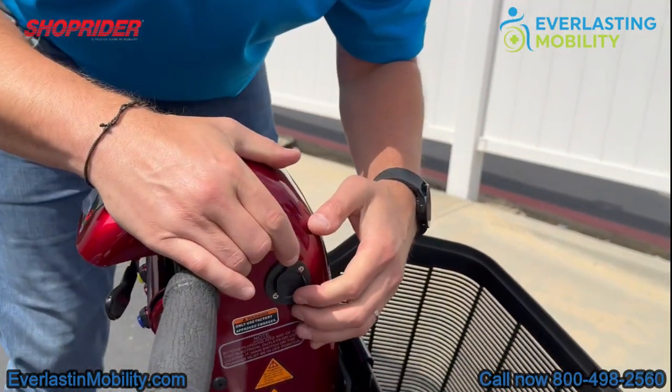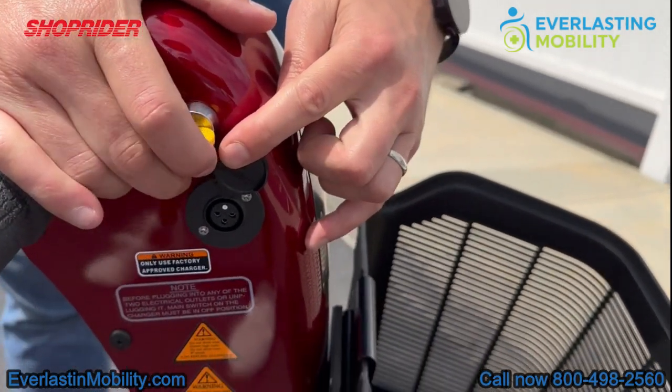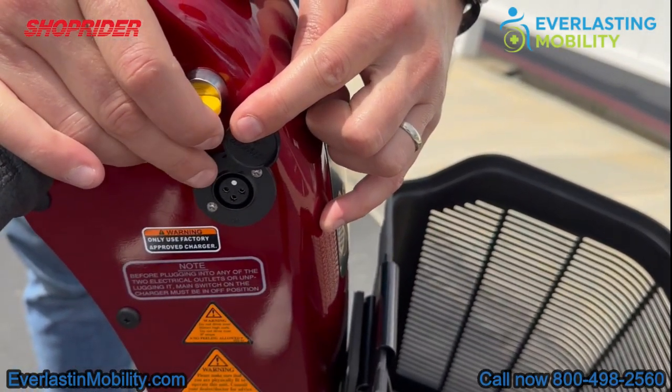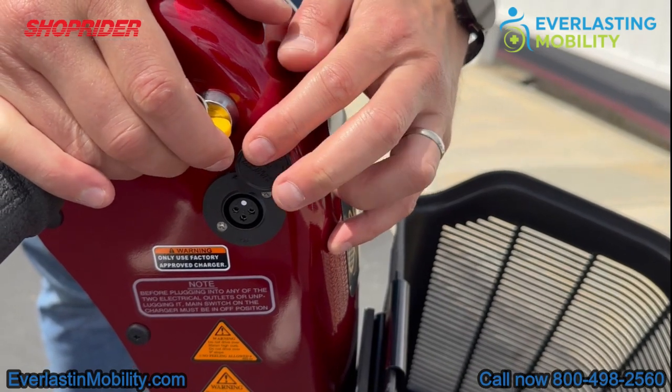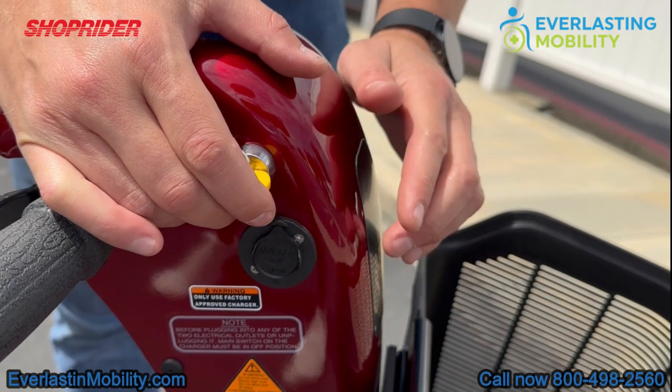The charging port is located up high on the tiller, which is a really nice feature. Prior to this, many scooters required you to charge at the base, meaning you'd have to bend down. Having it located up high is something a lot of customers appreciate.